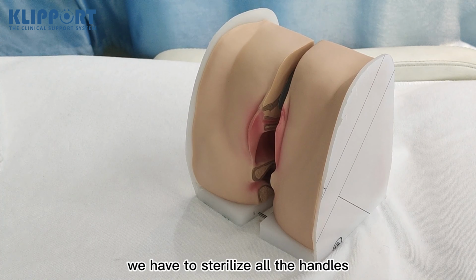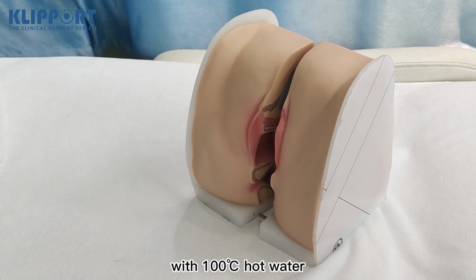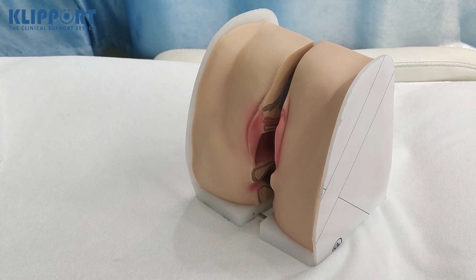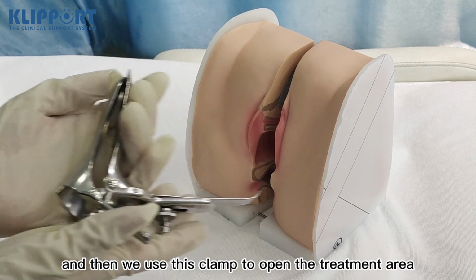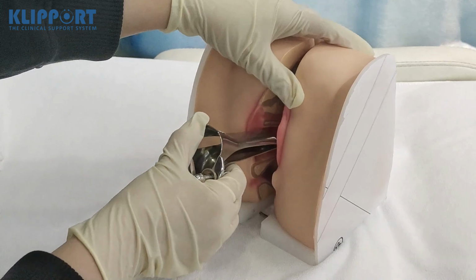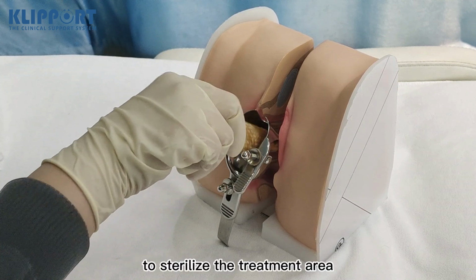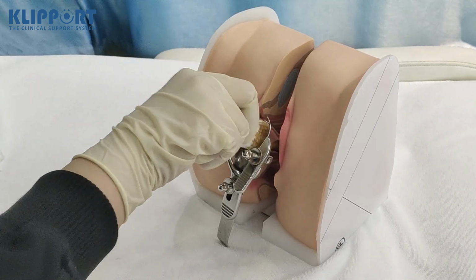Before the treatment, we have to sterilize all the handles with 100-degree hot water and ultraviolet. And then we use this clamp to open the treatment area. And then we use iodophor to sterilize the treatment area.